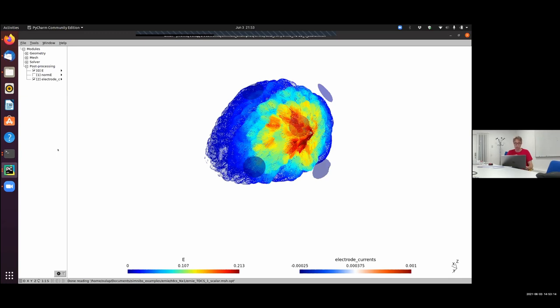Again, use headreco, not mri2mesh, so that the T1 information about how the coordinate system runs for this subject is not changed. And then it should be very straightforward. You just take the last three numbers in this matrix and just enter them as the target position. It should work. If not, let us know.